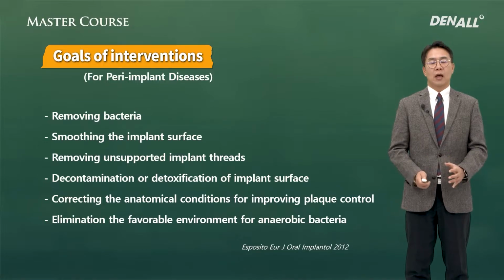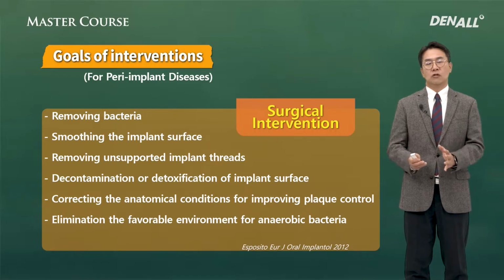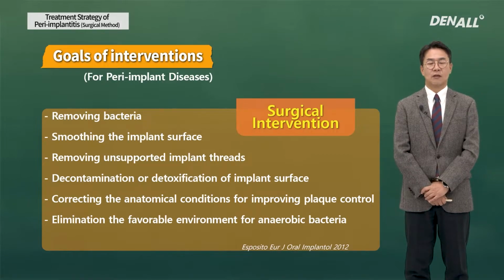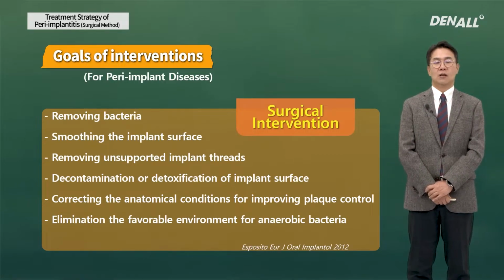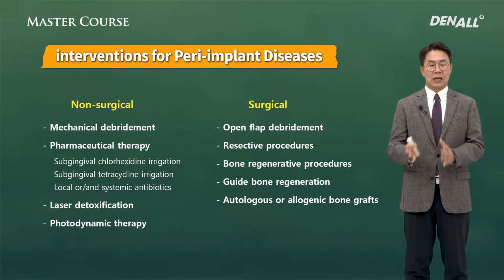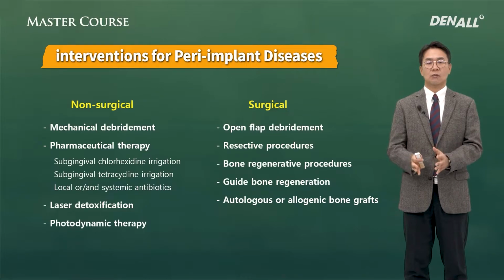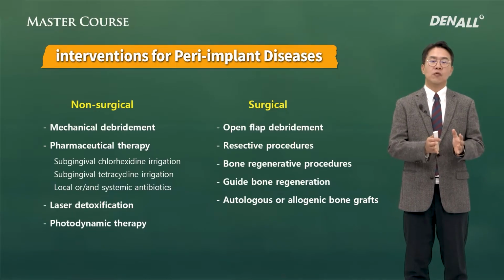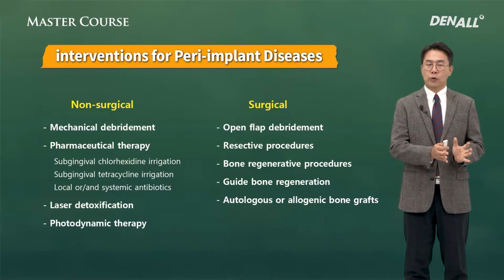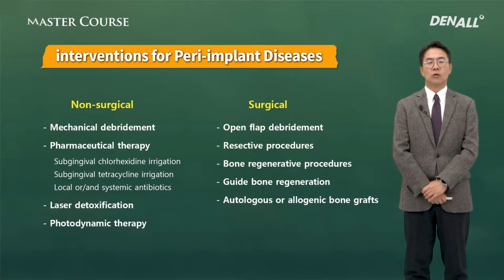Let's look at the purpose of intervention. Surgical method can satisfy all these factors. So should we just resort to the surgical method to accomplish these goals? Rather than that, we need to apply the non-surgical method first. Surgical and non-surgical methods can be divided as shown. Surgical method is done after non-surgical method is performed. Therefore, even if you do surgical method, bear in mind that non-surgical method is required to detoxify the implant surface as well. Do take note of this.